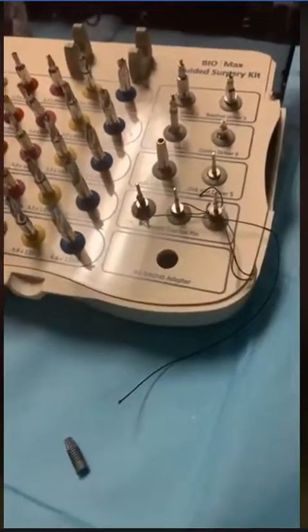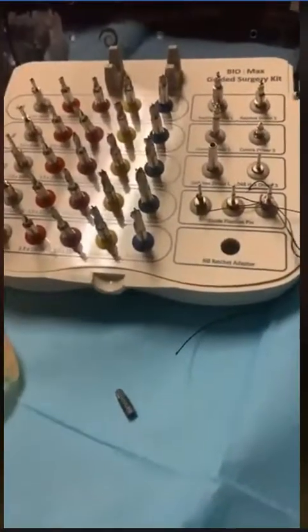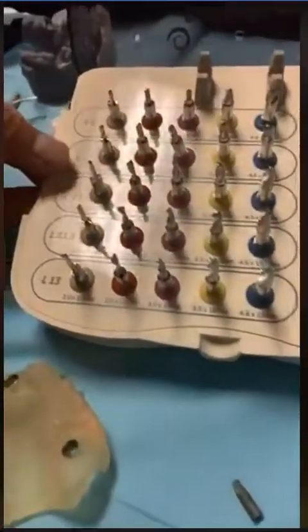Okay, now I want to show you something interesting that I always do, and take a look at what's underneath this kit.